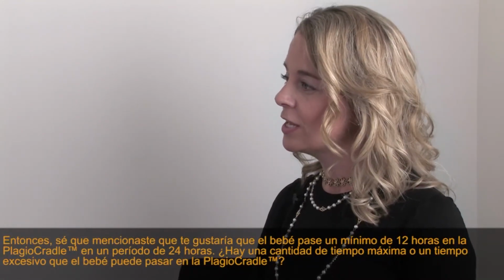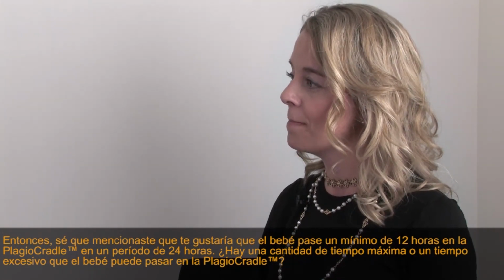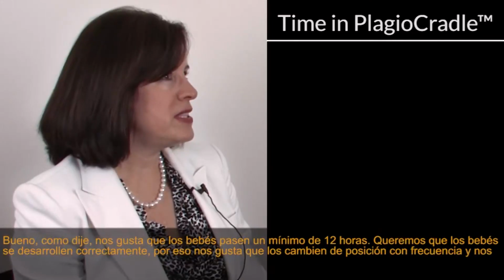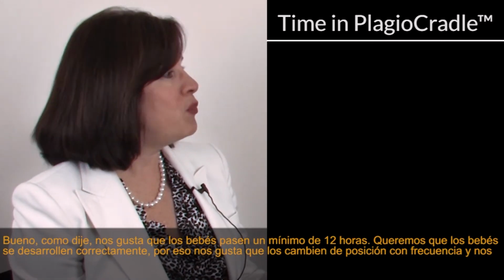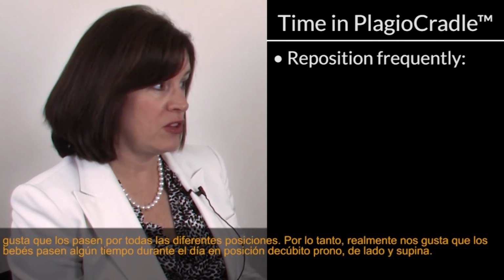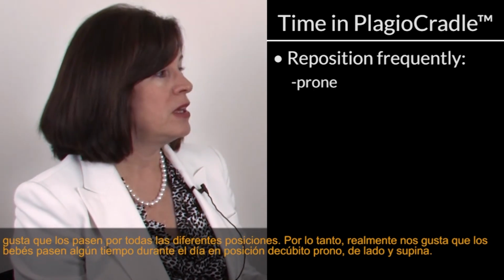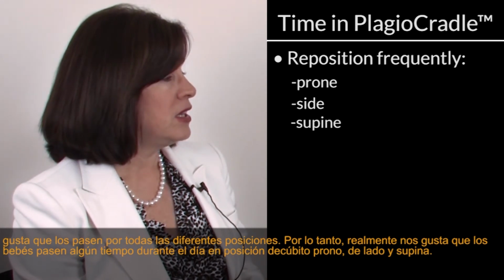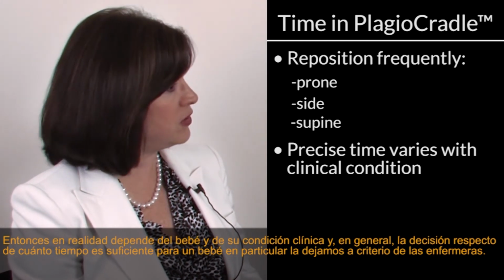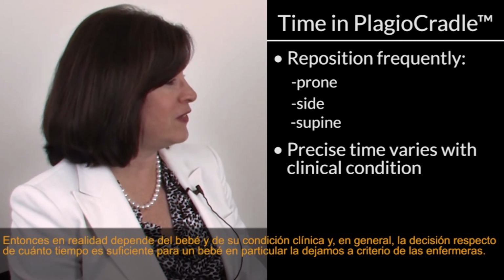So I know you mentioned that you would like the babies to spend a minimum of 12 hours in the cradle in a 24-hour period. Is there a maximum amount of time or too much time that they can spend in the cradle? So we like babies to spend, as I said, a minimum of 12 hours. We want babies to develop properly, so we like them to be repositioned frequently, and we'd like them to be positioned in all different positions. So we do like babies to spend some time during the day prone, on their sides, as well as supine. So really it depends on the baby and their clinical condition, and we usually leave it up to the nurse's judgment to make that decision in terms of what's enough time for any individual baby.